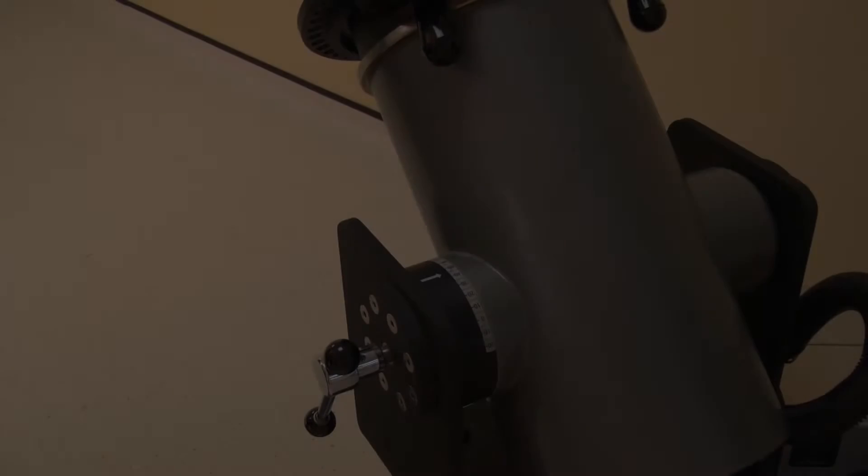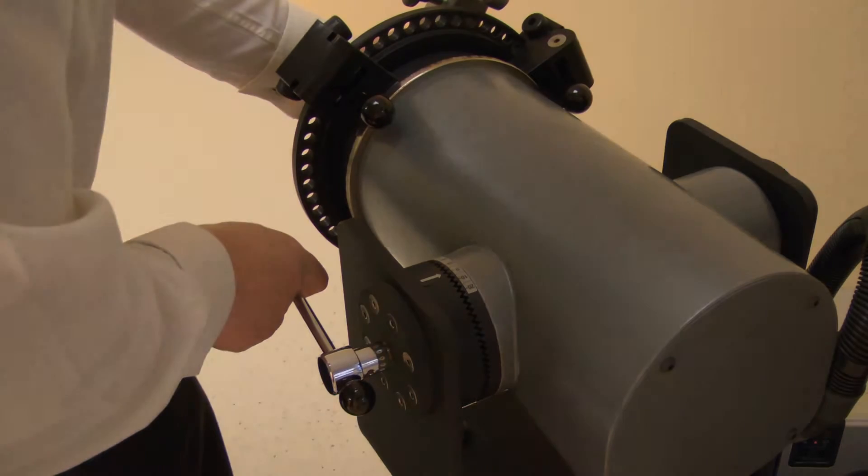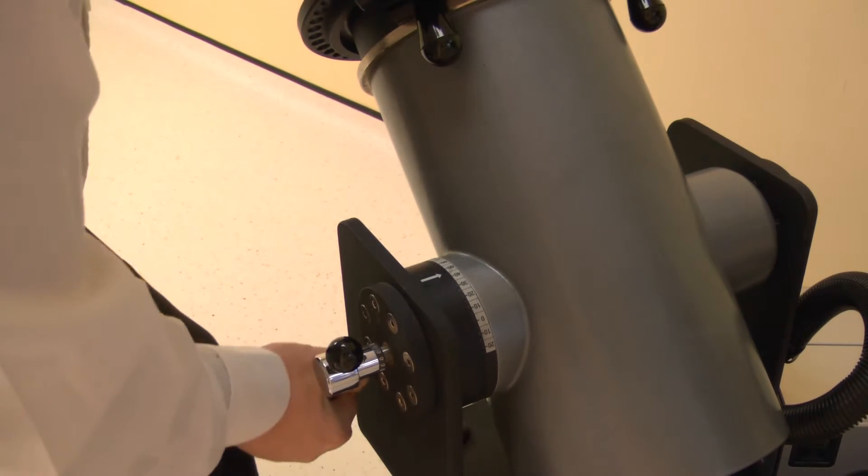Now set the dynamometer tilt. Release the locking handle, then change. Adjust the tilt angle to 70 degrees. Lock by tightening the handle.